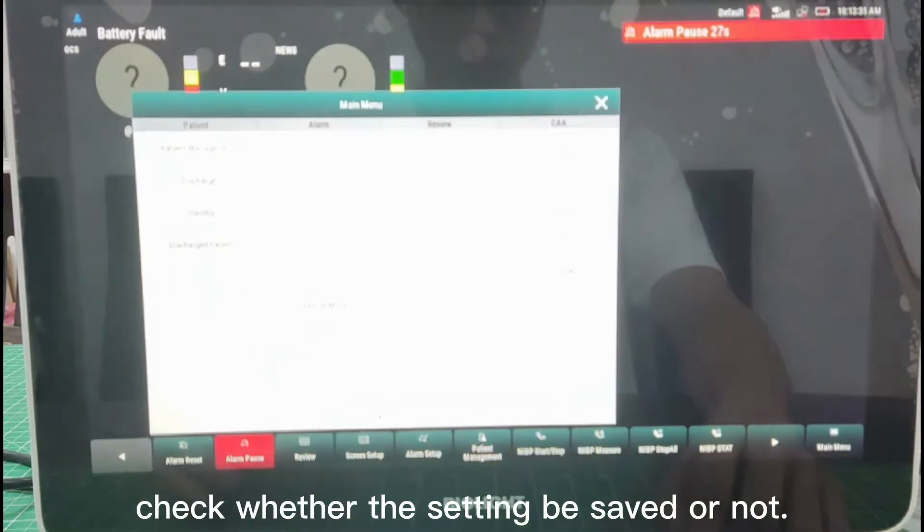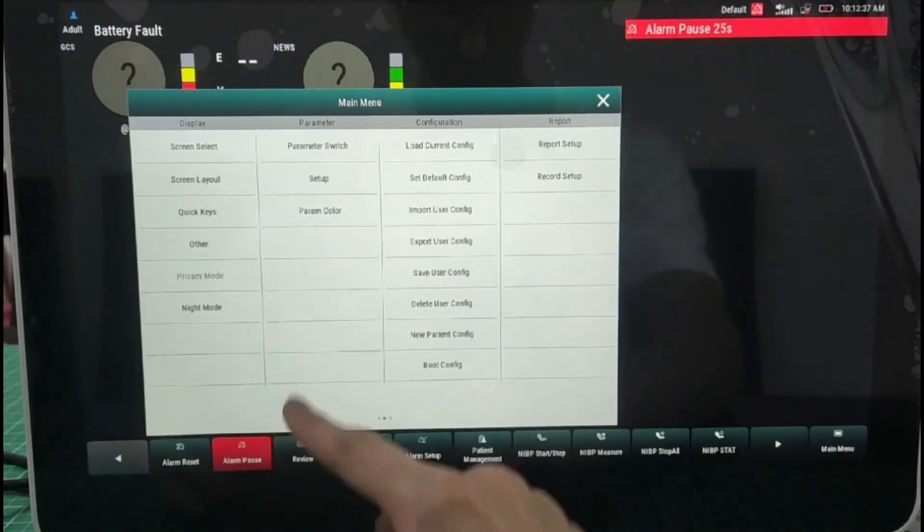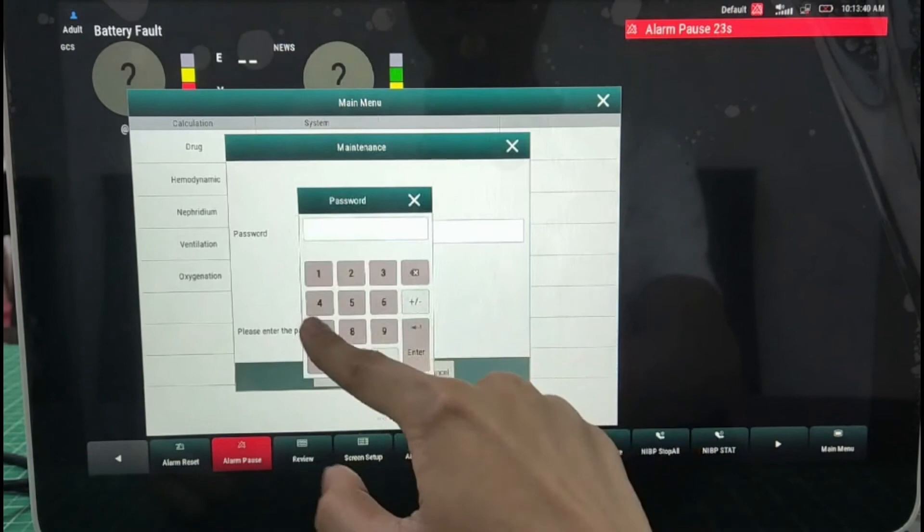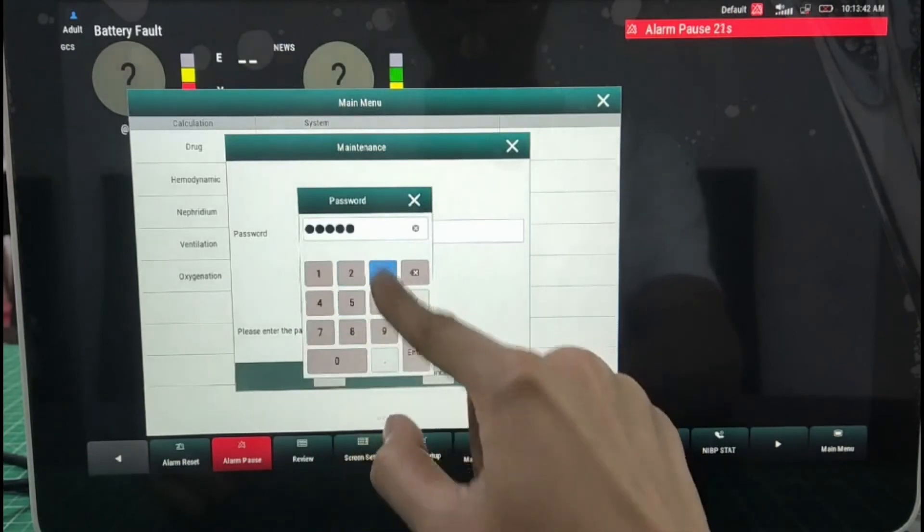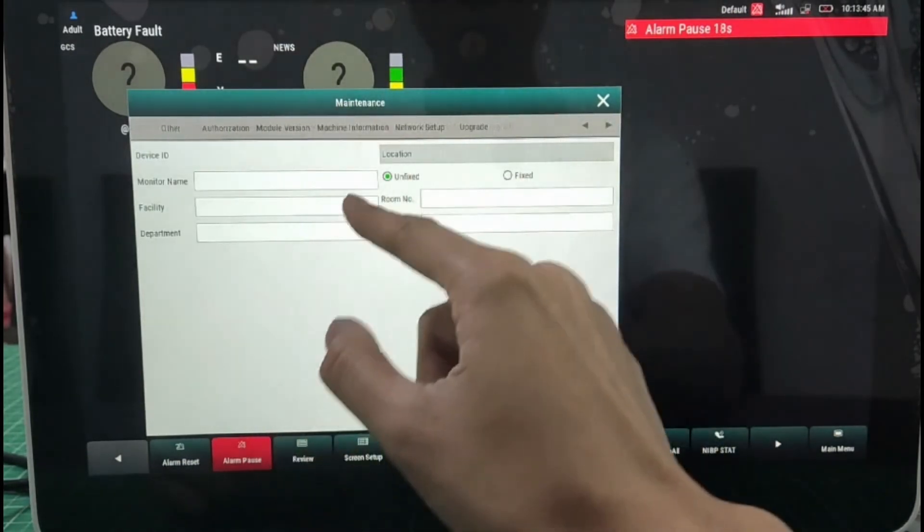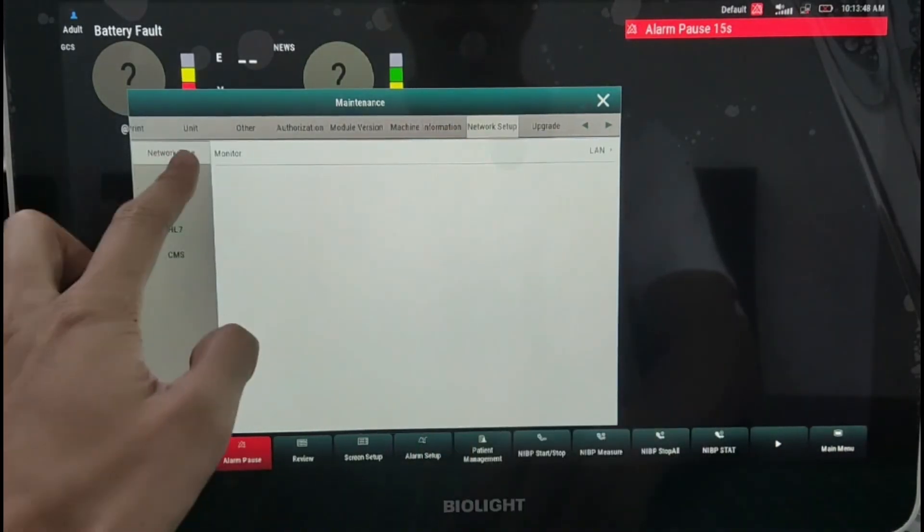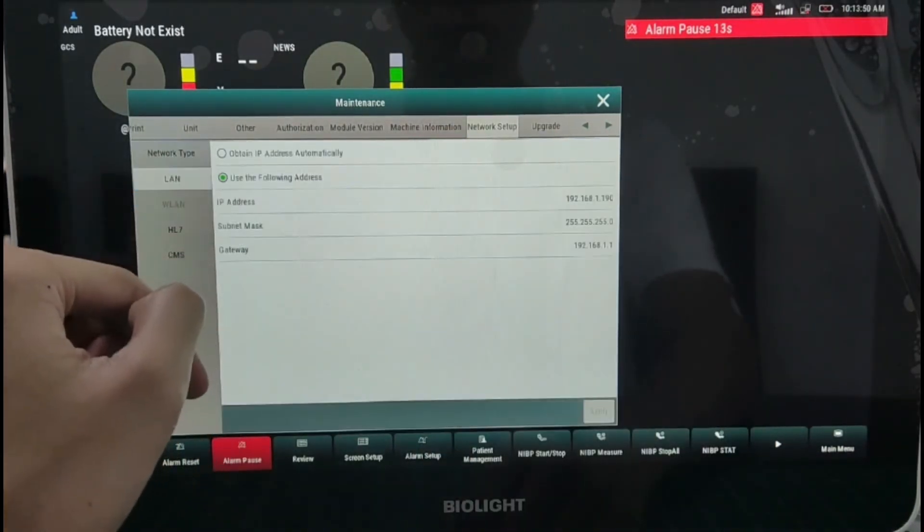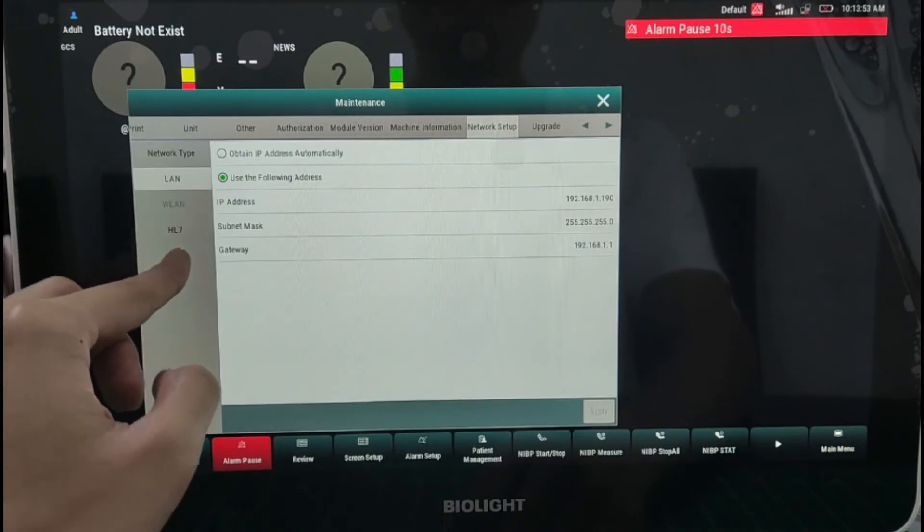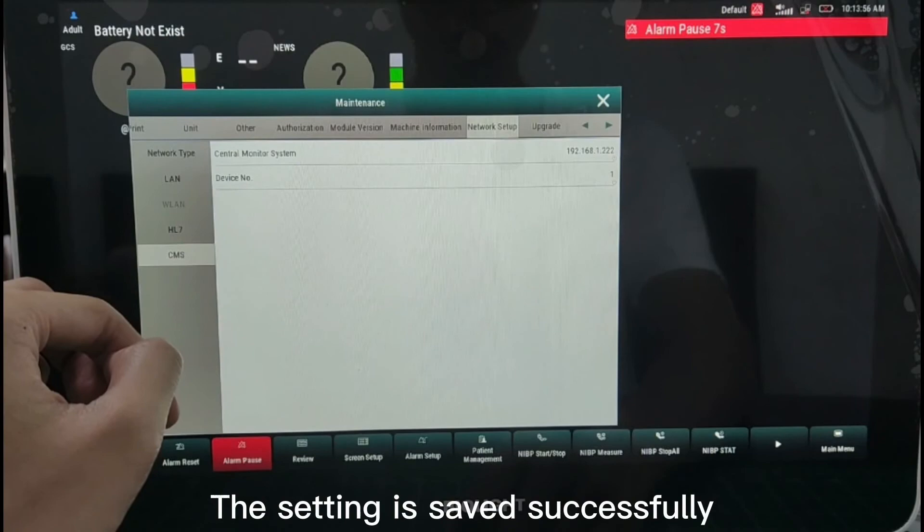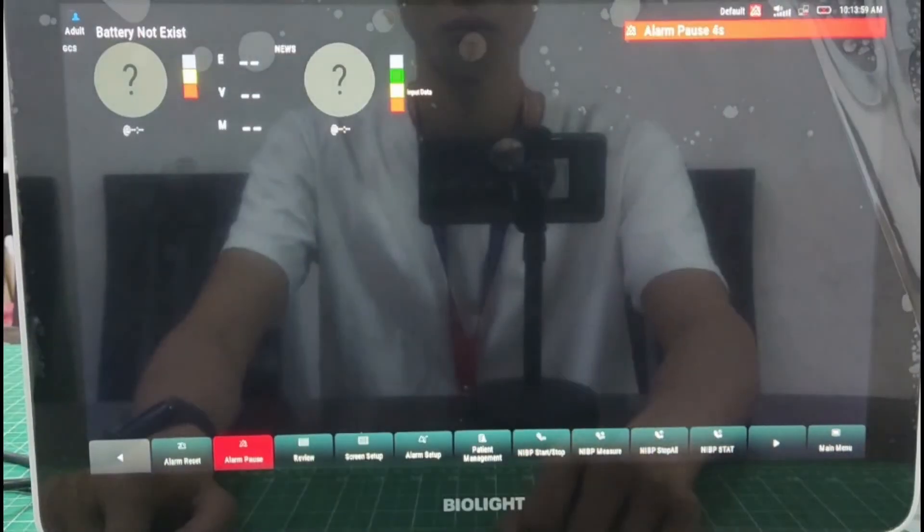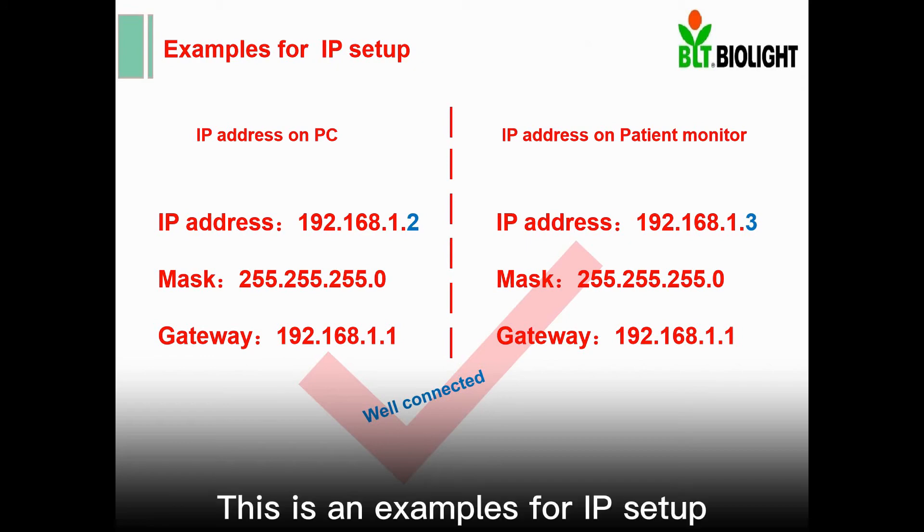Check whether the setting be saved or not. The setting is saved successfully. This is an example for IP setup.